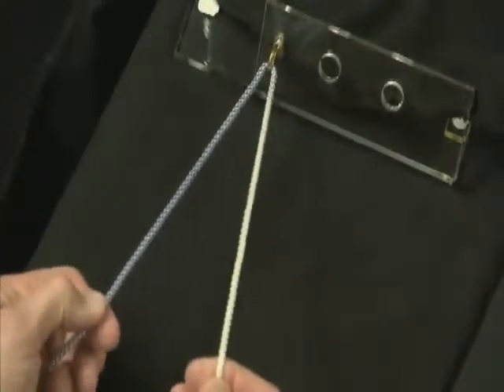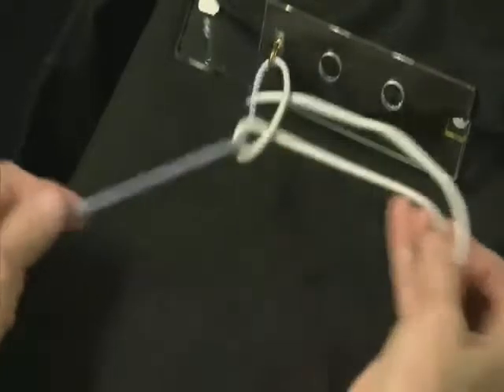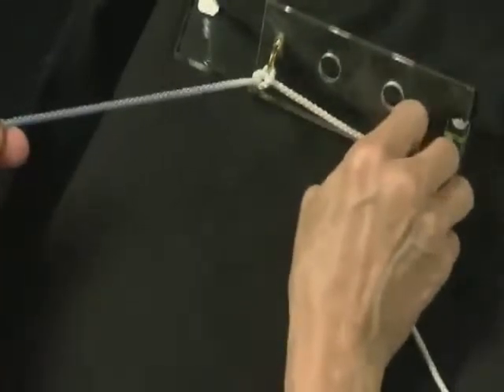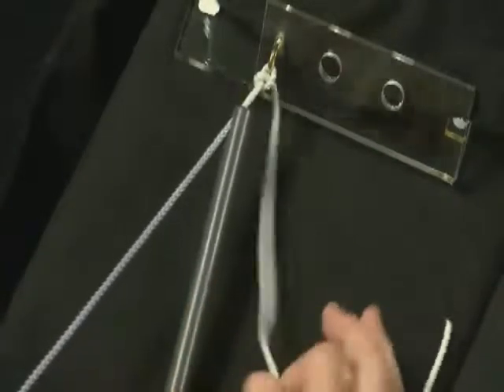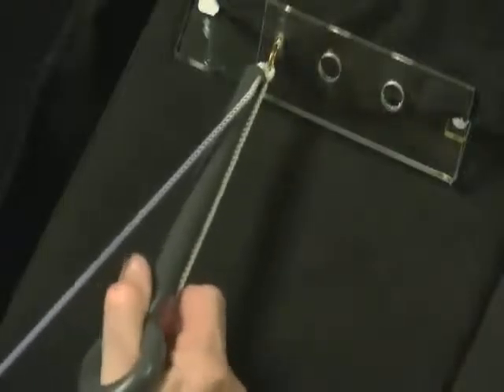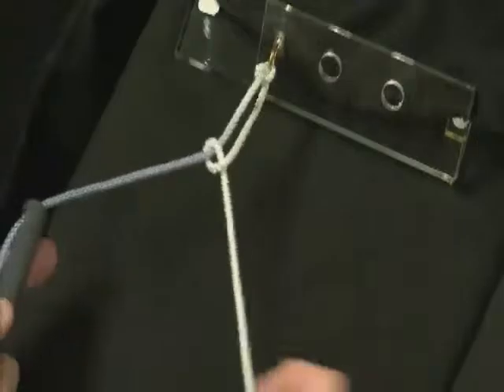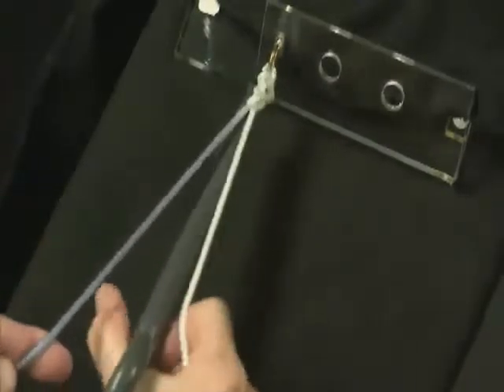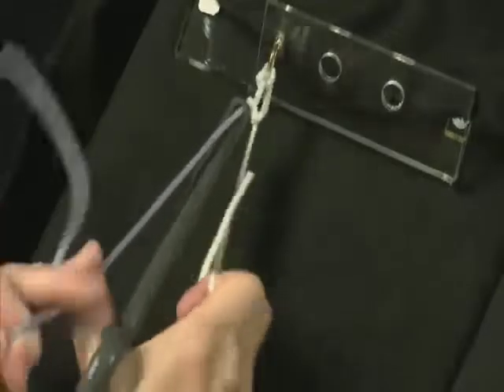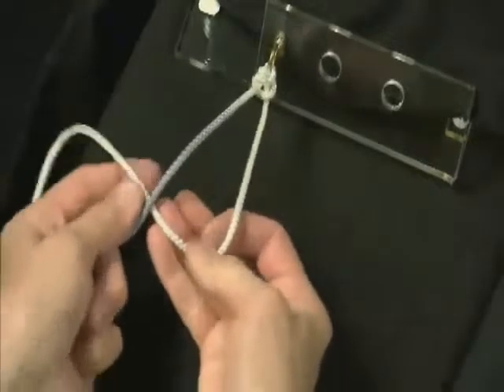You want to be equal in your post and your limb. We'll do an under, and you push this down each time with your knot pusher. Your knot pusher is going to be on your post. You're pushing it down, keeping tension. Then do another under, push this down, keeping tension all the while. Then another under. And that's our base knot.